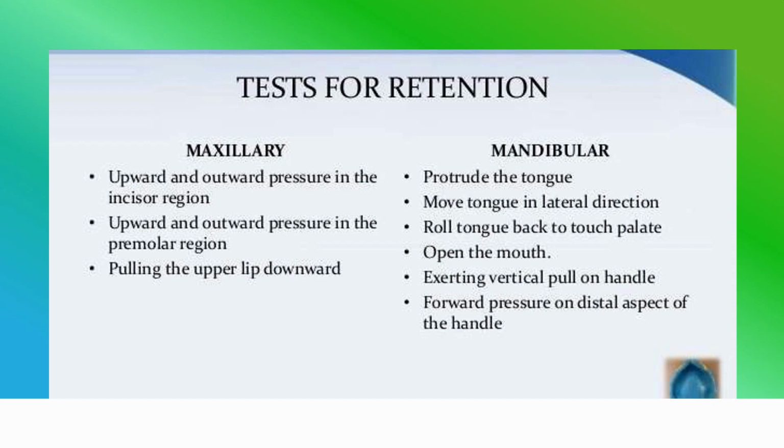Now for the mandibular arch, ask the patient to protrude the tongue or move the tongue in a lateral fashion, or roll the tongue back to touch the palate. Open the mouth, exert a vertical pull on the handle, and apply forward pressure on the distal aspect of the handle.